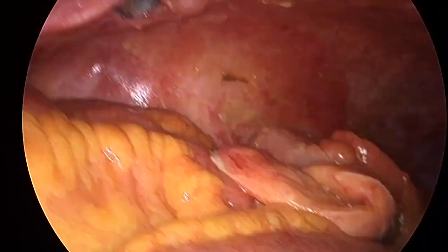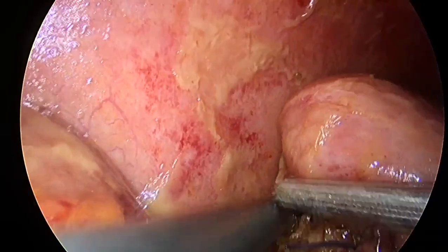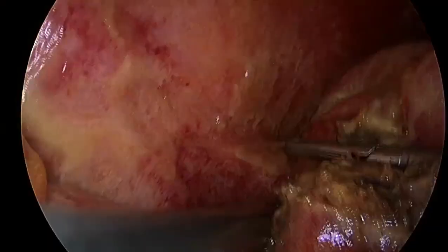The specimen is retrieved in an endo-bag, the abdomen is washed out, and the surgical field is carefully checked for any bleeding, iatrogenic injuries, or uncleared collections.